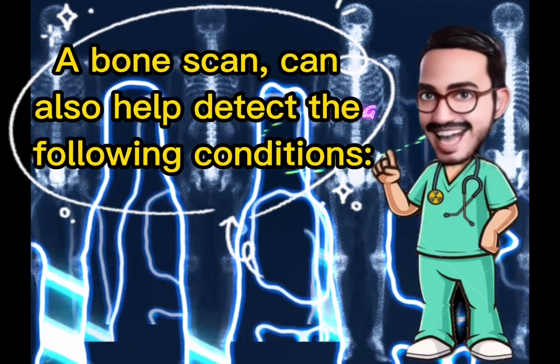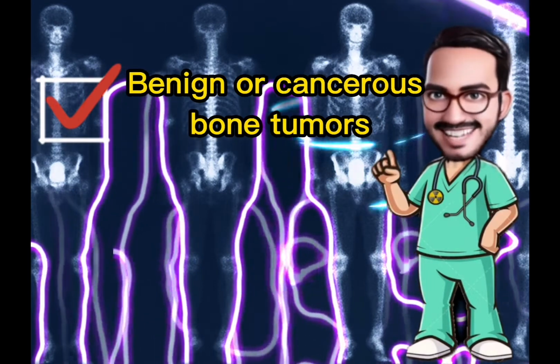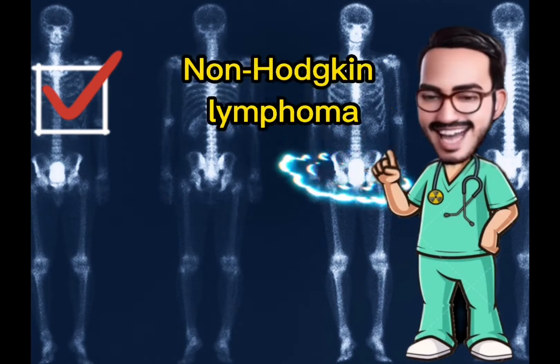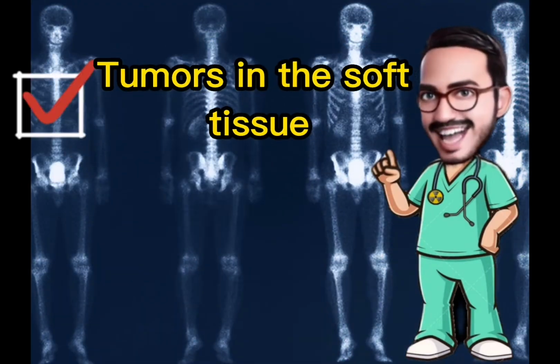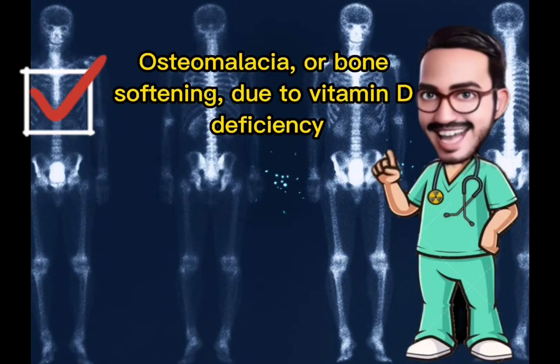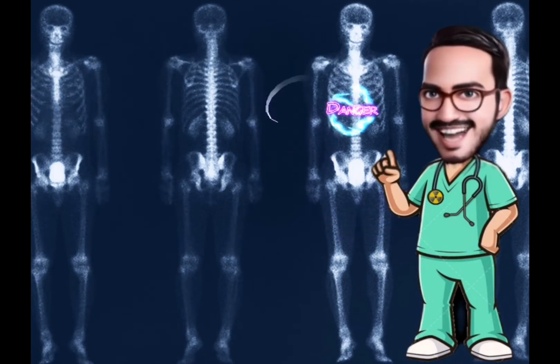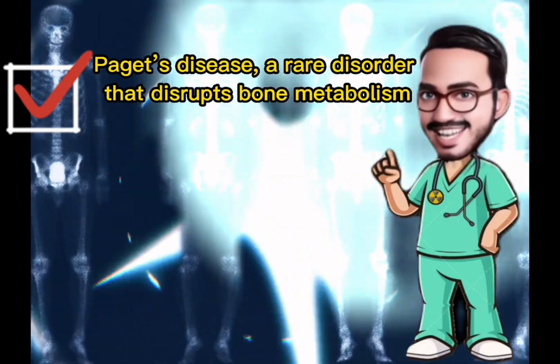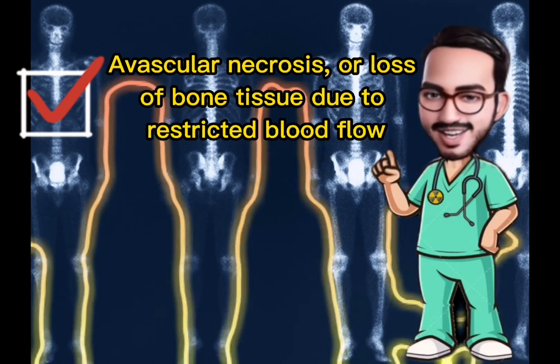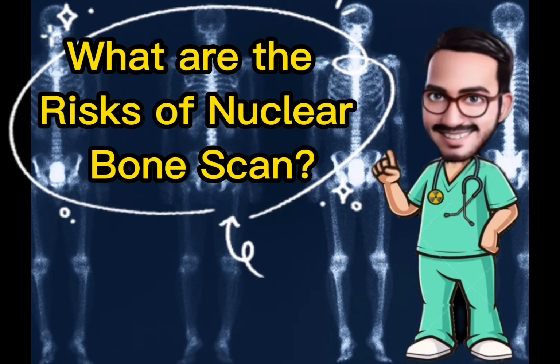A bone scan can also help detect the following conditions: benign or cancerous bone tumors, secondary or metastatic cancer to the bone, non-Hodgkin lymphoma, tumors in the soft tissue, osteomalacia or bone softening due to vitamin deficiency, osteomyelitis or bone infection, Paget's disease, a rare disorder that disrupts bone metabolism, and avascular necrosis or loss of bone tissue due to restricted blood flow. What are the risks of nuclear bone scan?